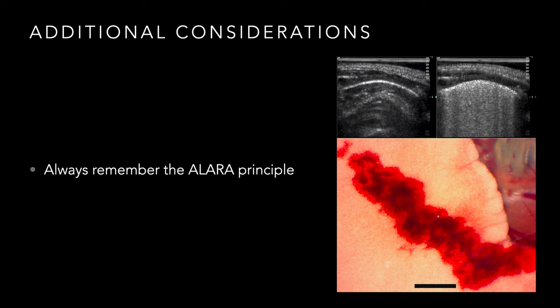But in the process, it compresses that water and the water decompresses, and the air in the water comes out of suspension and creates those little micro air bubbles. That's called cavitation. Then you see that plume eventually settle back out and return to its normal steady state. That cavitation principle can also happen in ultrasound as you compress and decompress the tissue. We measure this in the mechanical index, which is essentially the maximum negative force applied to the tissue.